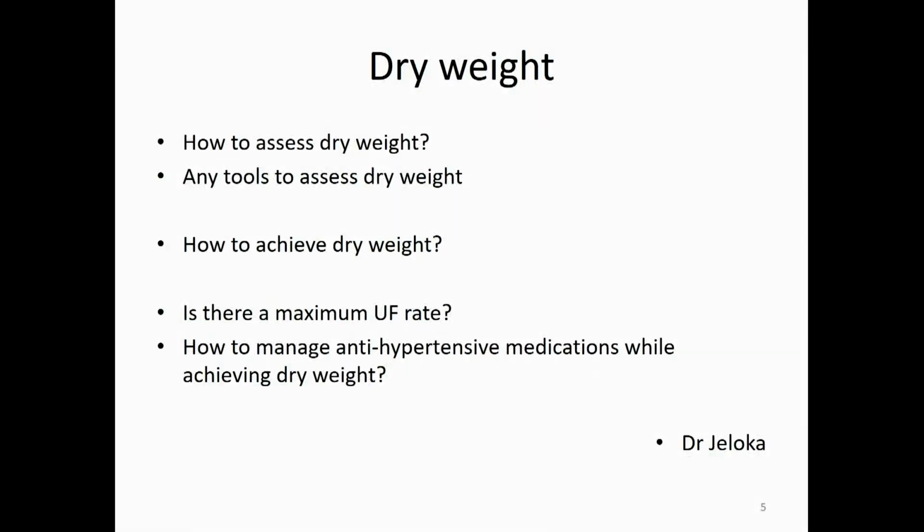And I think that is what the technician is saying. See that the technician has set the dialysate sodium correctly. It's nearer 135 rather than near 140. I think all these points you are familiar with. So what he mentions, theoretically it's easy to understand. In practice, when you meet those patients, it is difficult.